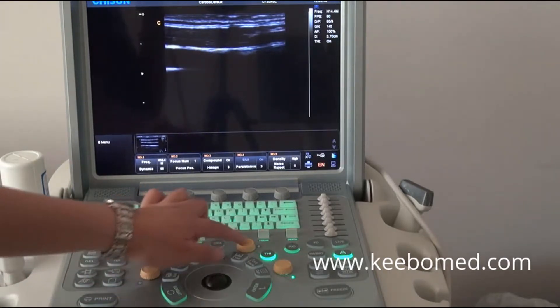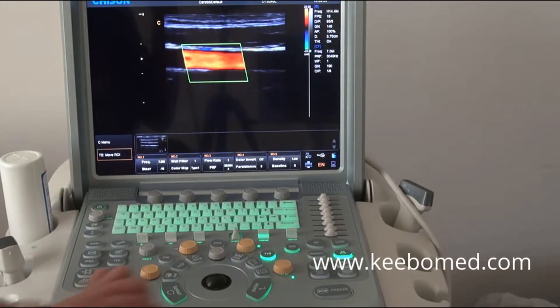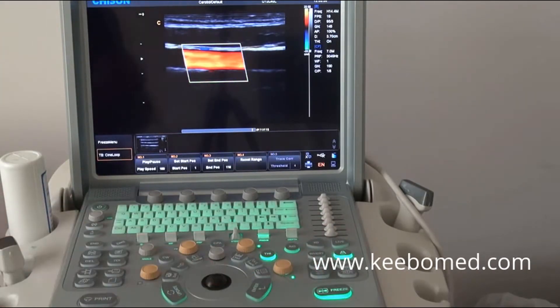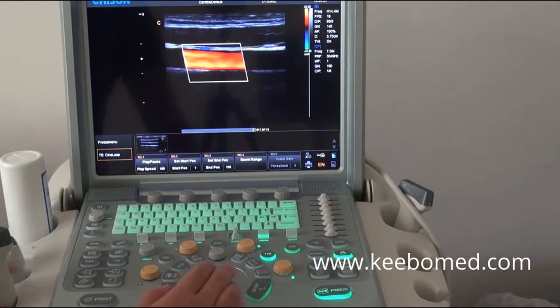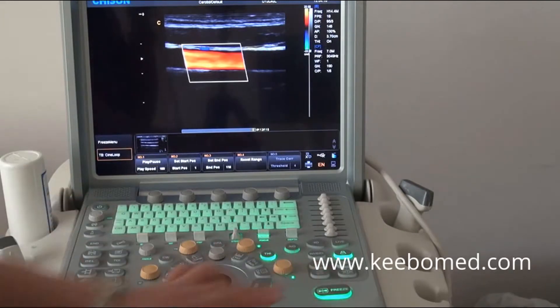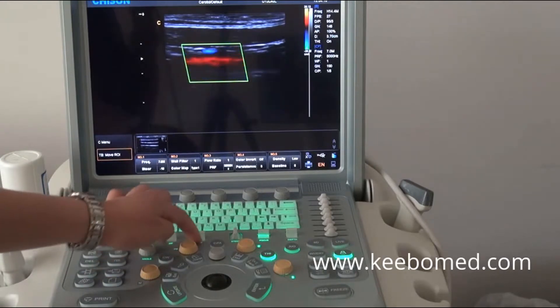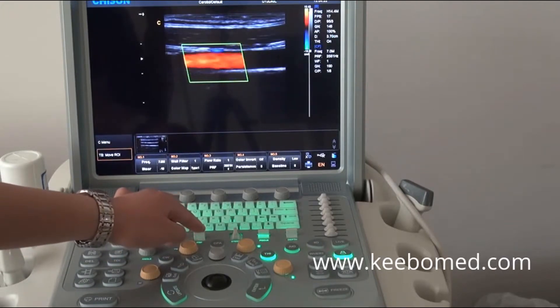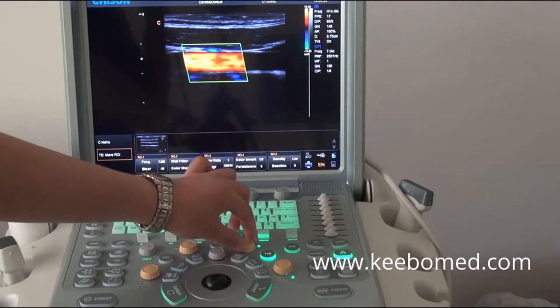After that, we can go into C mode — press the C key. For this color image, you can find there is no overflow and different color layers display very well. In C mode, we can adjust the PRF value with this key, and rotate the C key to adjust the color brightness.